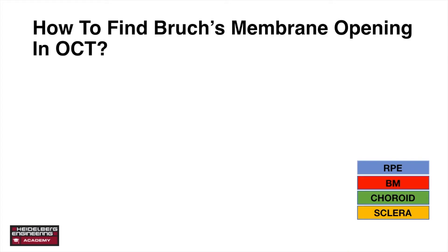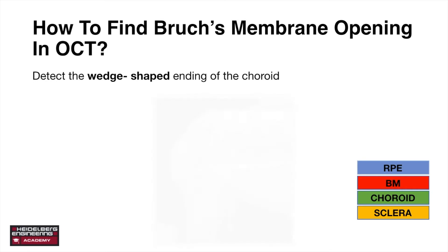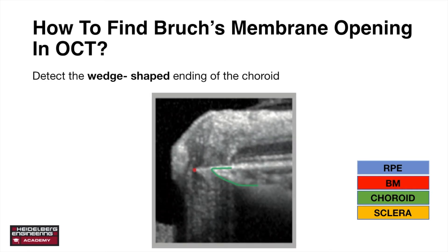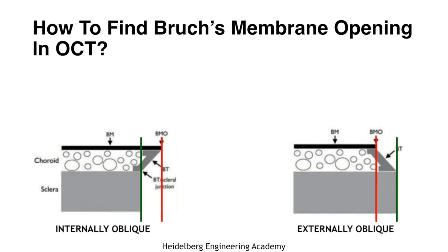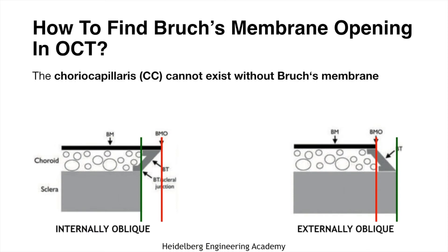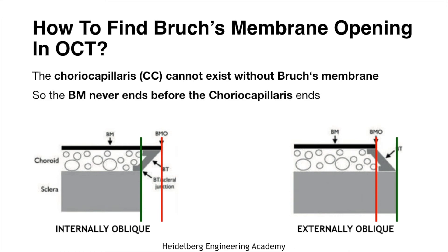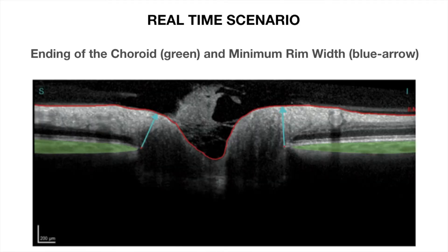How to find Bruch's membrane opening in OCT: first, detect the green wedge-shaped ending of the choroid — the BMO will be seen just adjacent to it. Bruch's membrane never ends before the choriocapillaris ending, whether in an internally oblique or externally oblique configuration, but Bruch's membrane can extend further than the choriocapillaris. In a real-time scenario, the ending of the choroid is shown in green and the minimum rim width is shown by the blue arrow.